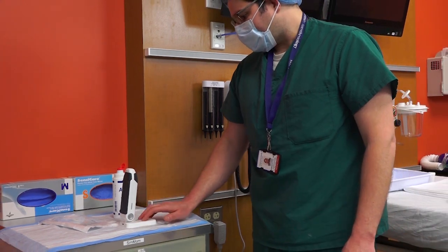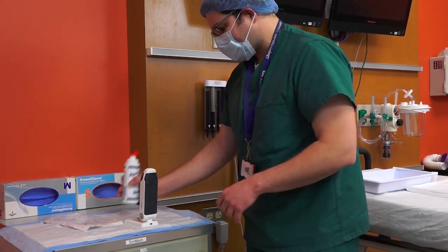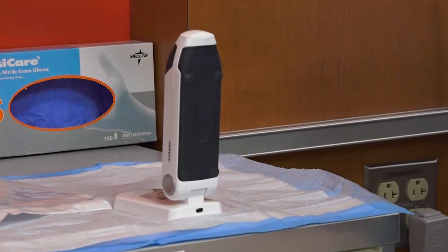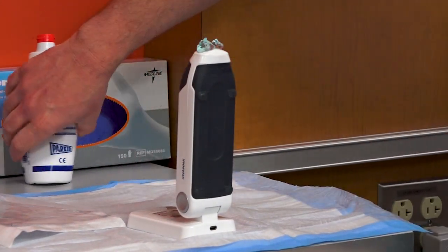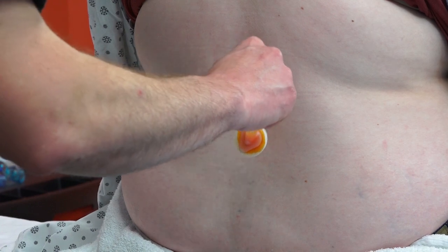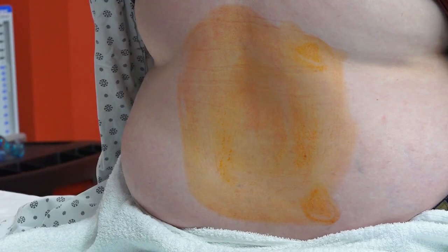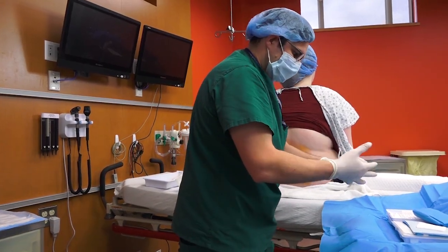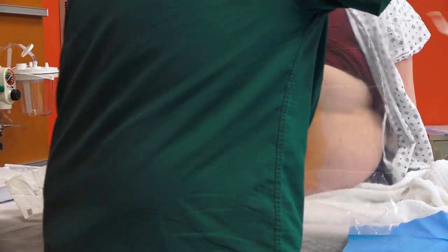So the next thing I do: I find a steady solid surface and place the ultrasound so it's in a safe position. I put a little bit of ultrasound gel and prep the patient's back. You're going to feel cold and wet — this is just a cleaning solution.